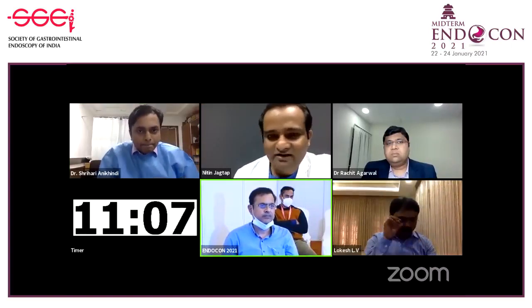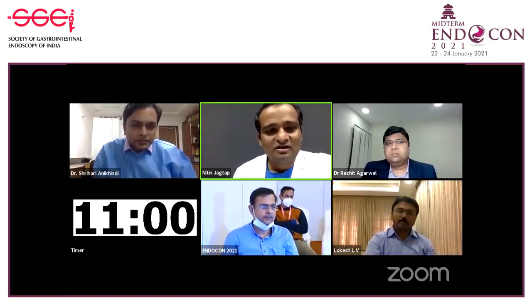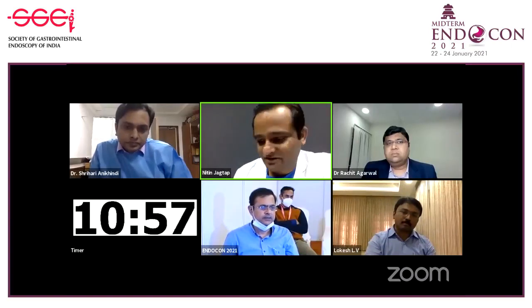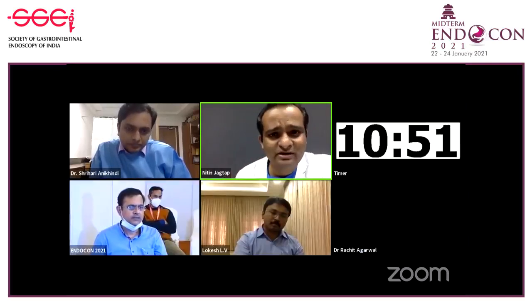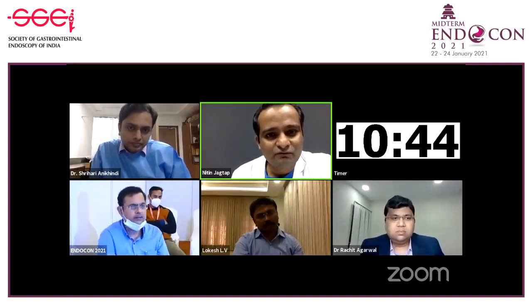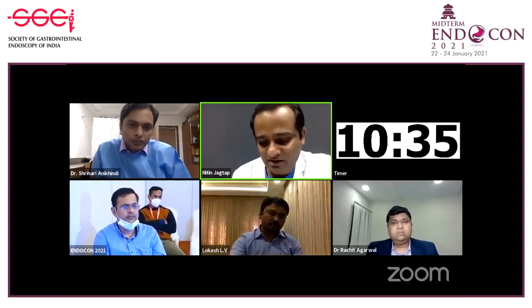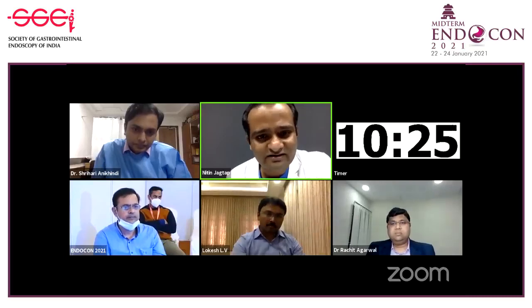That's a very good question, and I actually missed that in my presentation, I think. At our center, we use argon plasma coagulation. The initial few cases we did with a TT knife, but now we are shifting to APC, because that's most commonly available and that can be done by all gastroenterologists. So we use 100 watts at a flow of 1, and effect size is around 3 for the forced APC coagulation during ARMA. An additional point is that we initially used to inject saline with methylene blue into the submucosal plane, but after 10 cases, I think we stopped doing it, and we're directly doing APC now.